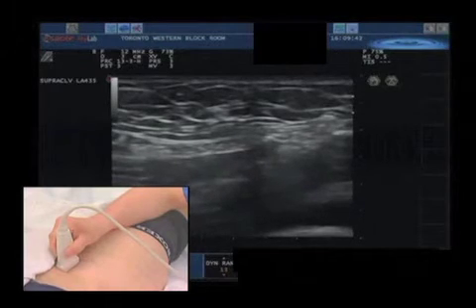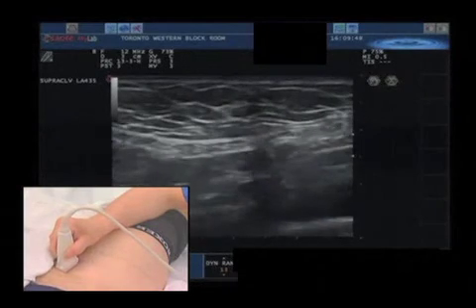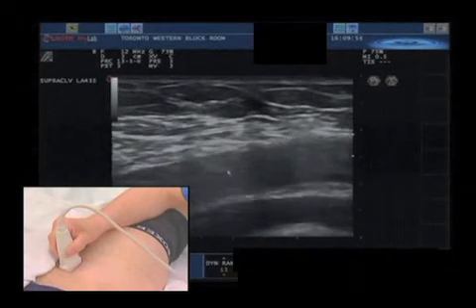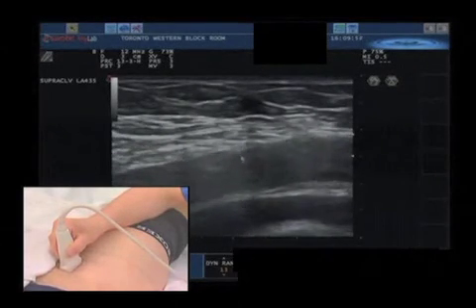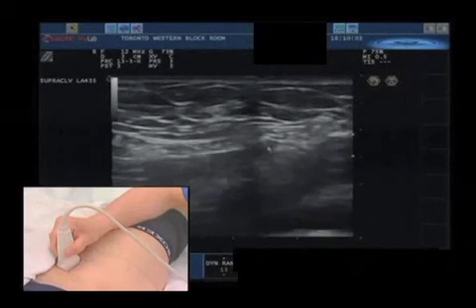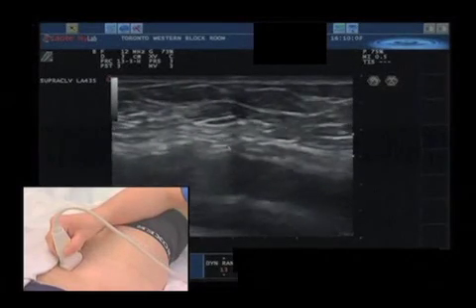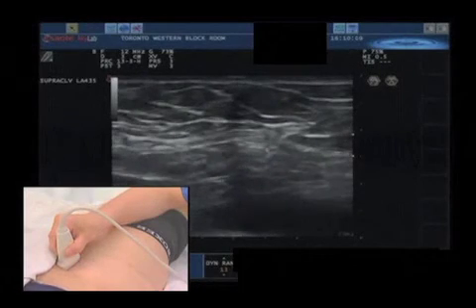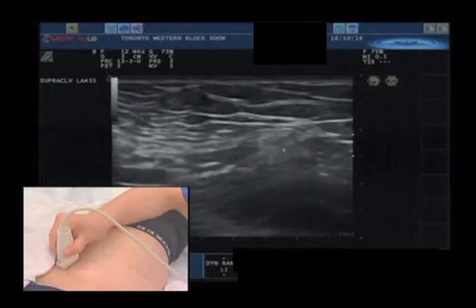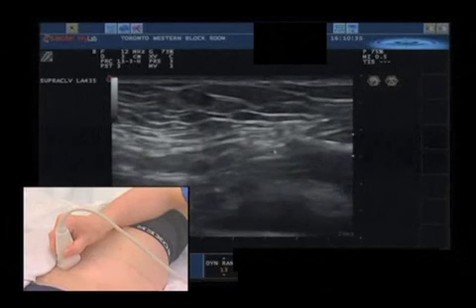With the focus set correctly, the starting point is the external iliac artery. On the medial side, you will see the beginning of the spermatic cord. This is the inferior epigastric artery — now you have a clear delineation of the spermatic cord. Moving medially, it is clearly seen here — a beautiful image — and you may appreciate the structures within.